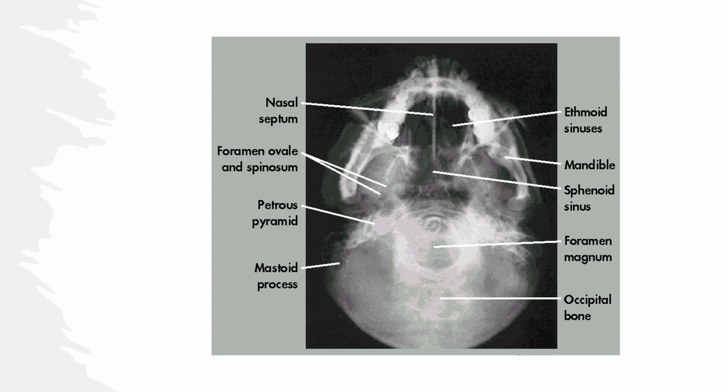You may see the foramen magnum. You may see the dens and the anterior arch of C1 immediately posterior to the oral pharynx. So it goes ethmoid sinus, sphenoid sinus, oral pharynx, anterior arch of C1, odontoid, foramen magnum. Okay, and then occipital bone superimposed by the patient's cervical spine.